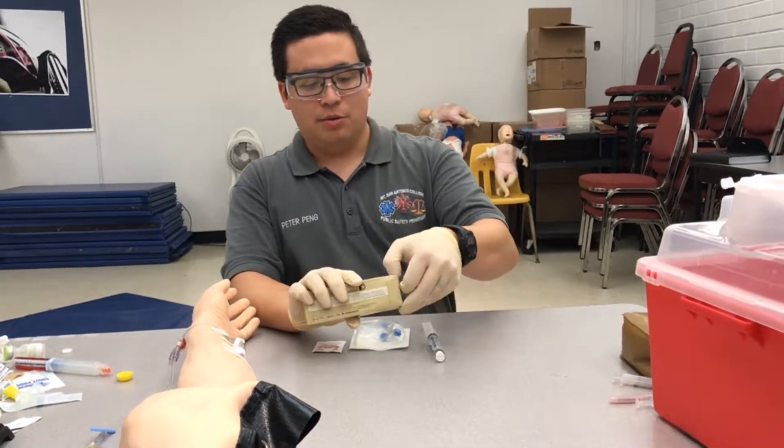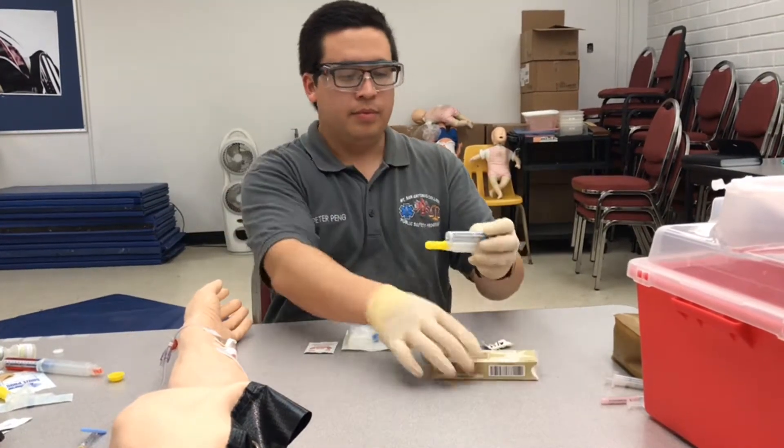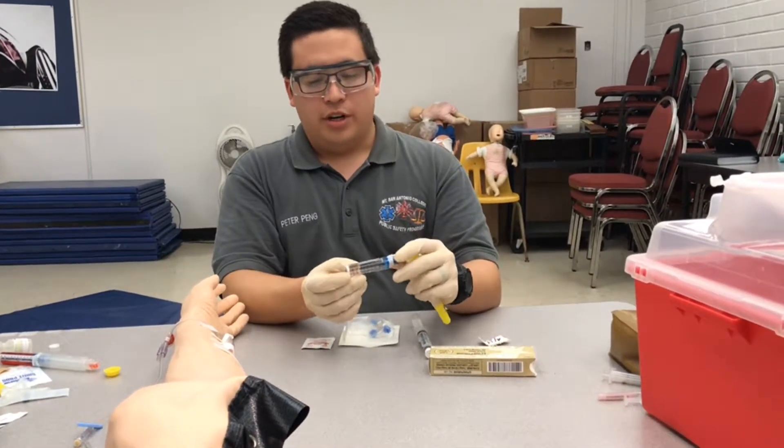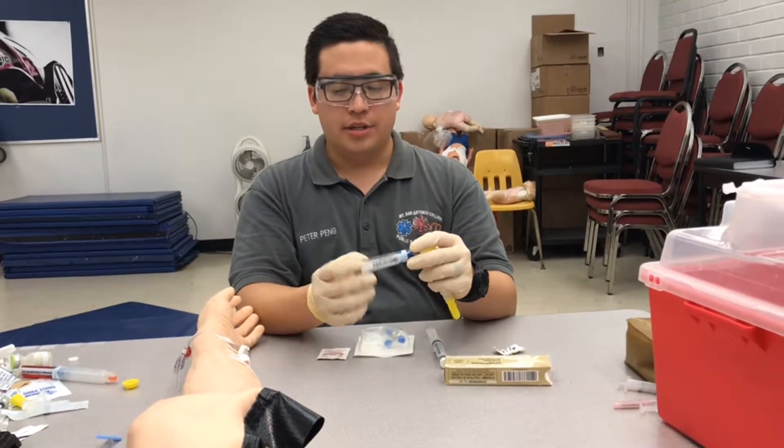I'm going to take it out of the box and DICE it one more time. So it's the correct drug, right concentration, integrity looks good, it's clear, and expiration is the same.